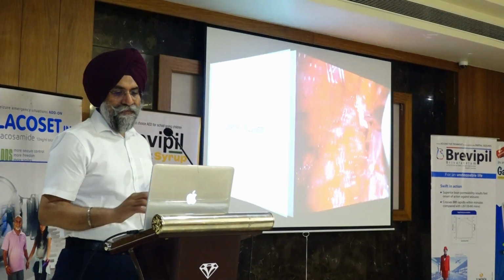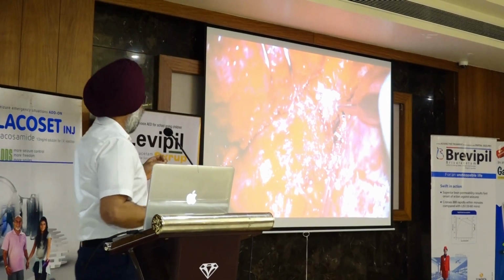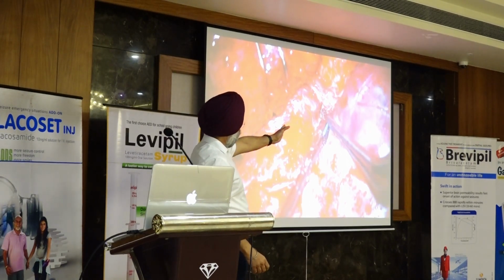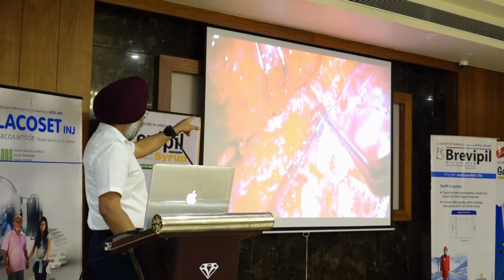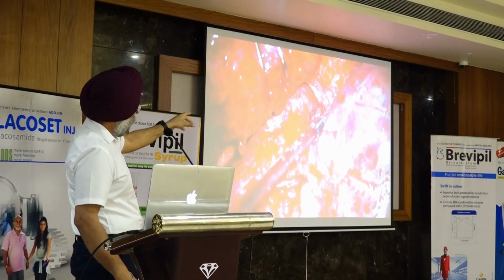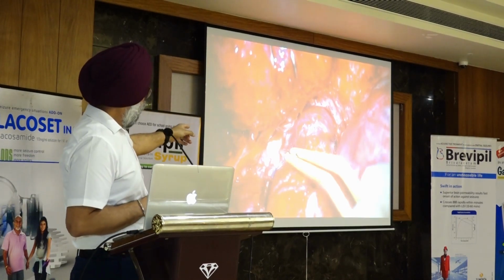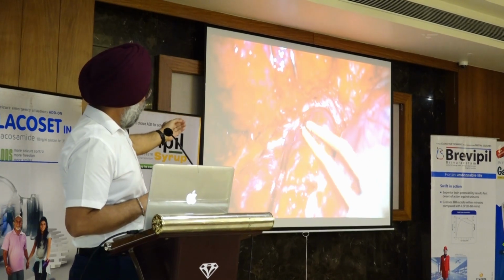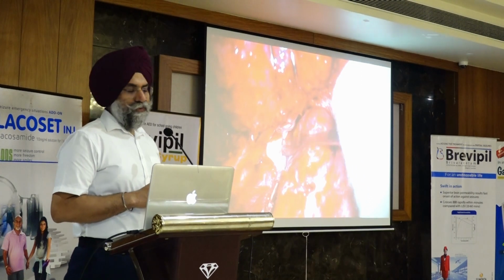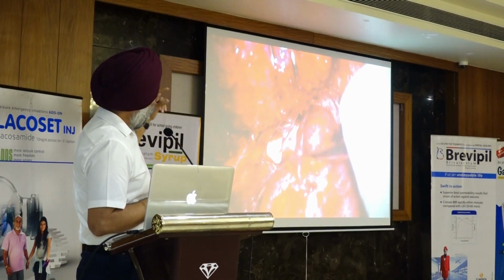So this is a video of cavernous sinus dissection. Right? I can tell you that on this side is the temporal and this side is the frontal side. This is the orbito-frontal band, orbit, right? The meningo-orbital band is being cut. This is the temporal base, and a lot of bony protuberances are there which we need to drill. Actually, the craniotomy is a frontotemporal craniotomy and zygomatic osteotomy.